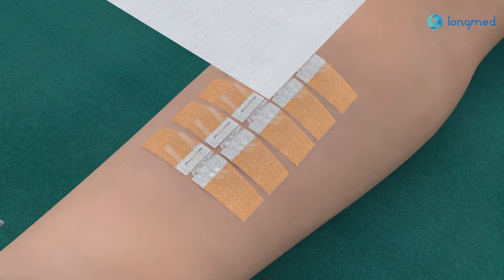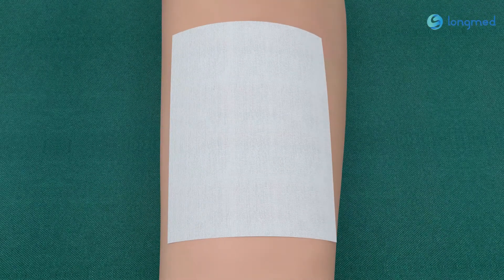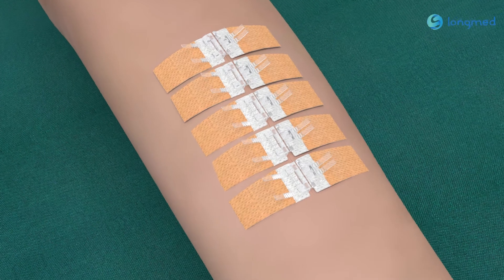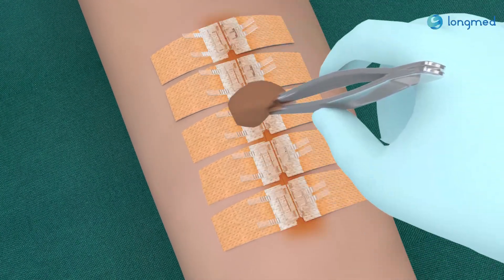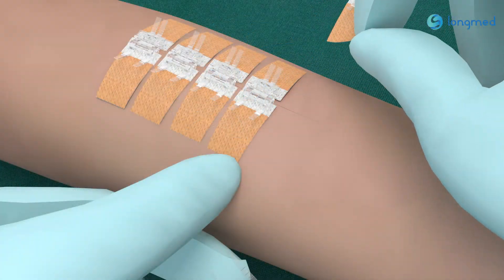Eight: after suture, clean the wound and cover the incision with a dressing larger than the wound closure device to avoid incision contamination. Nine: postoperative observation and removal — observe the condition of the wound, clean the wound directly or apply medicine, and keep the wound clean.